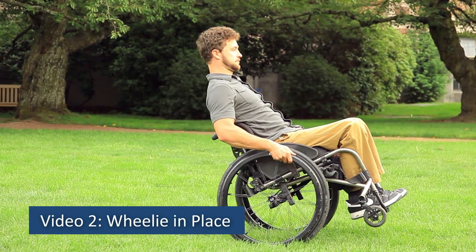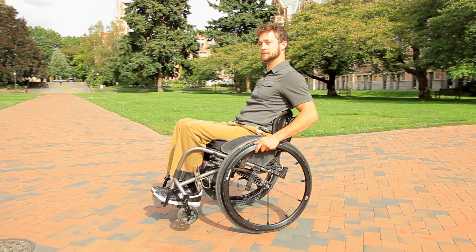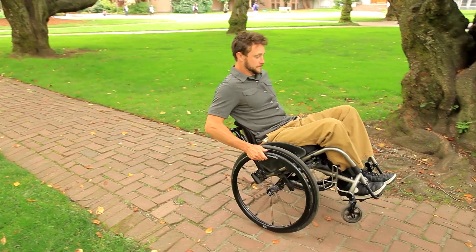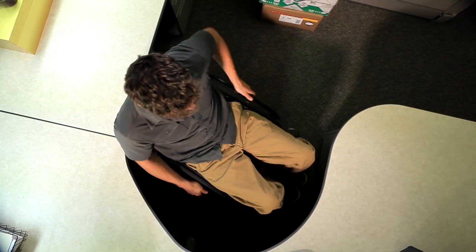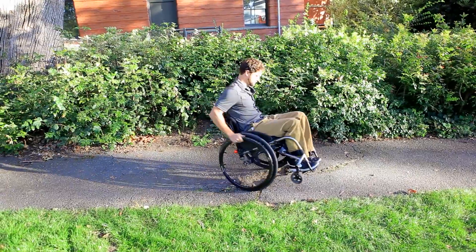Video 2: Wheelie in Place. The wheelie in place is one of the three foundational wheelie techniques that will help you navigate a variety of situations and terrains in your manual wheelchair. The key to doing a wheelie in place is knowing the balance point of you in your wheelchair.